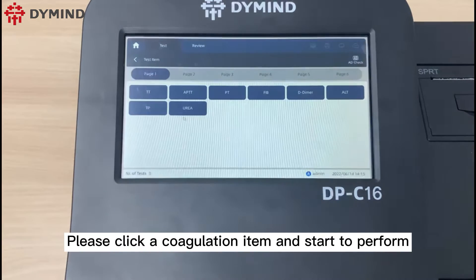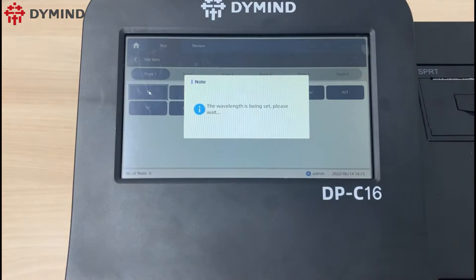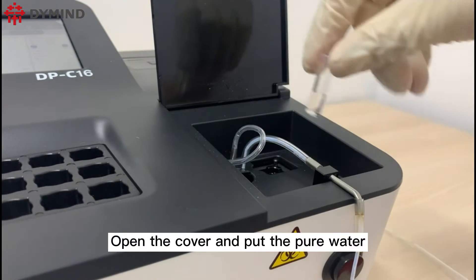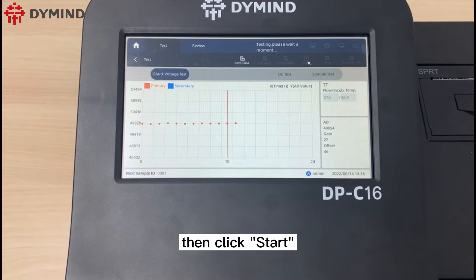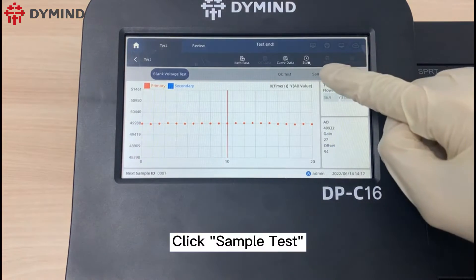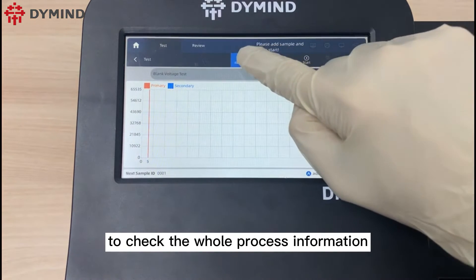Please click a coagulation item and start to perform. Open the cover and put the pure water into the coagulation adapter assembly, then click start. Please note that the dots need to locate on the same metal line. Click the sample test item parameter to check the whole process information.